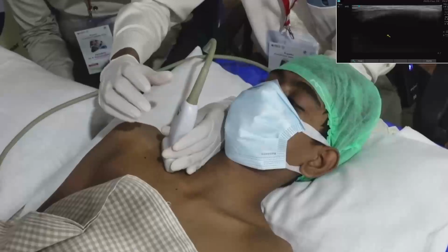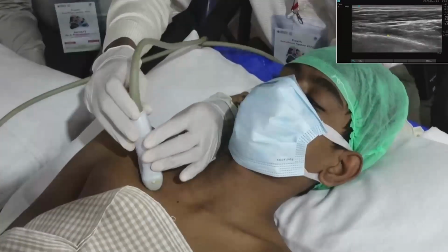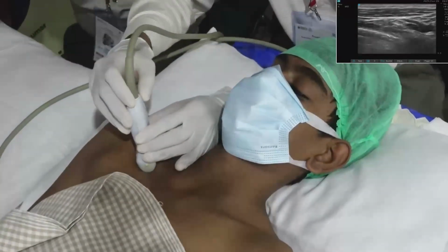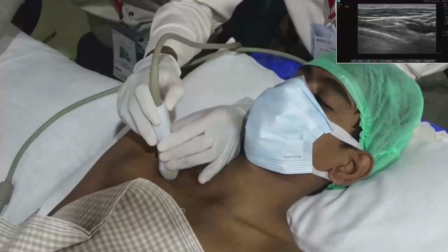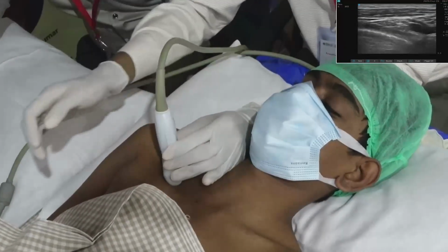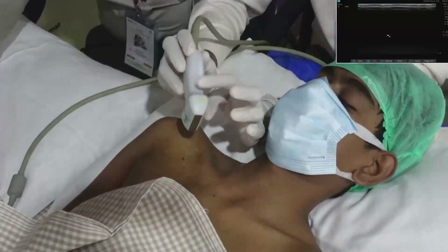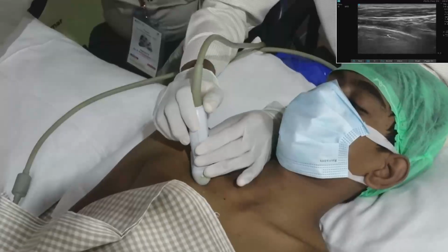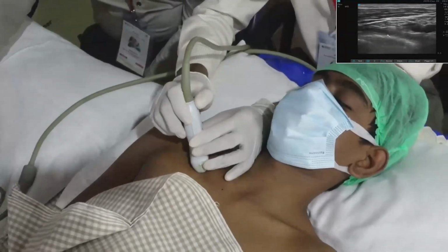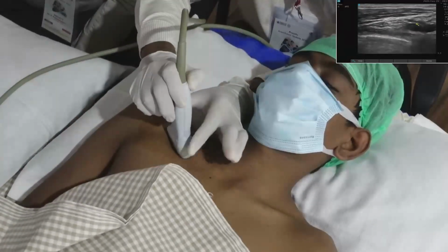So I will start from the clavicle, then I slip the probe just below the clavicle. What we see is some vessels. This is not very clear. So the pulsating structure, my pointer is towards the medial side.